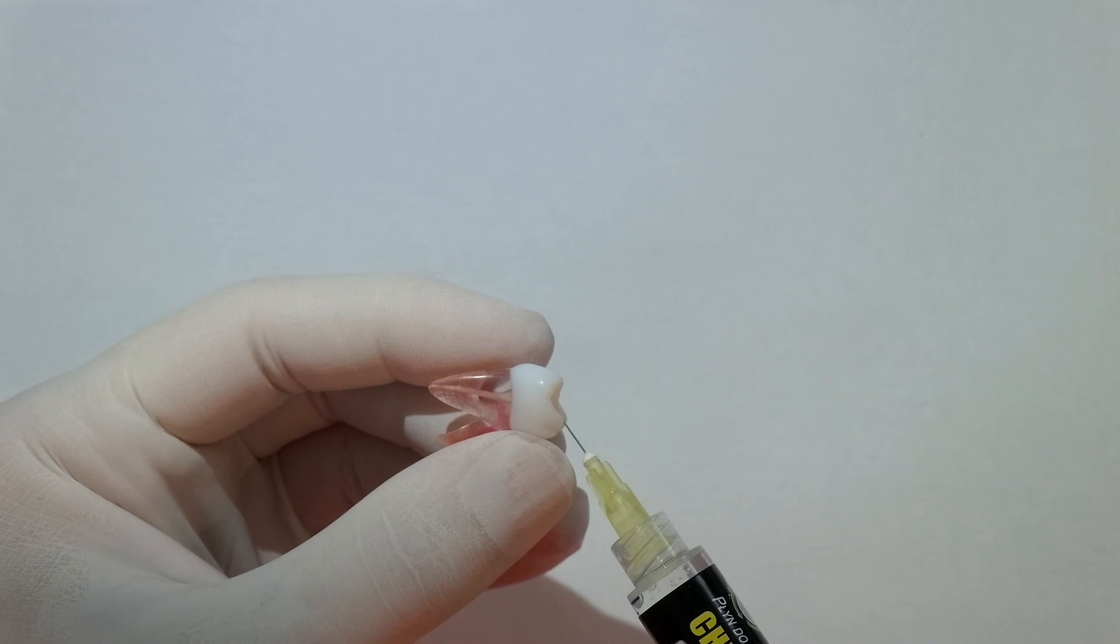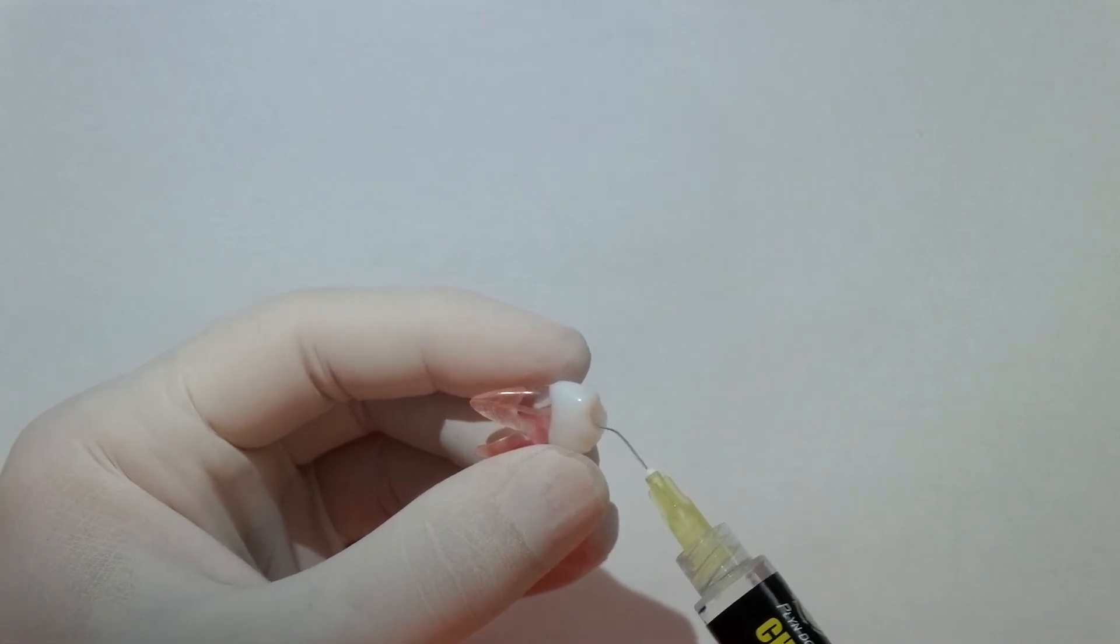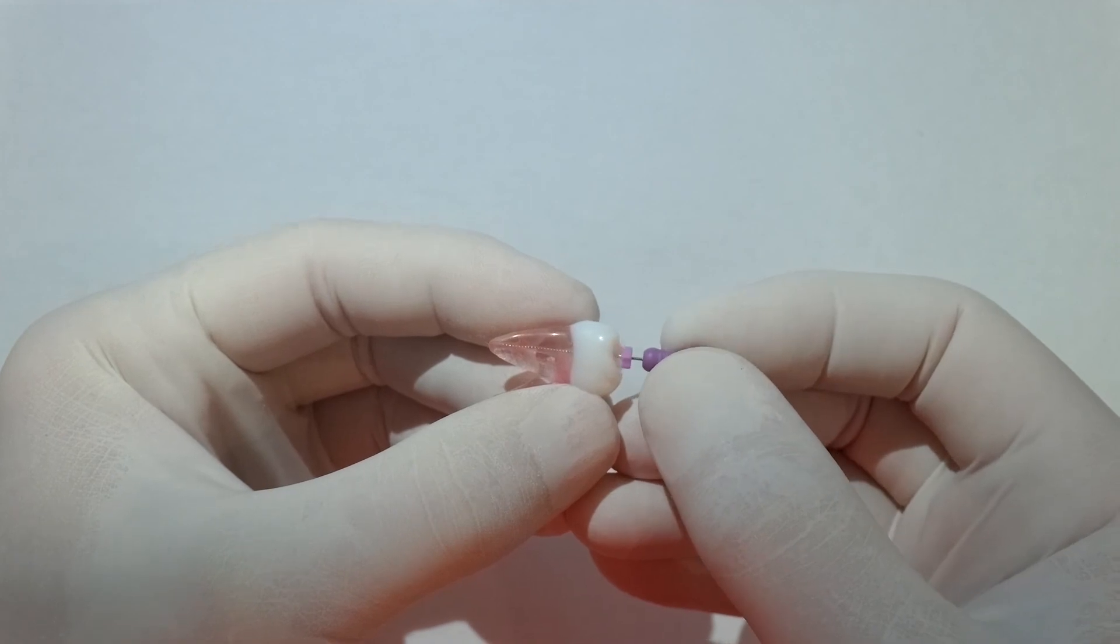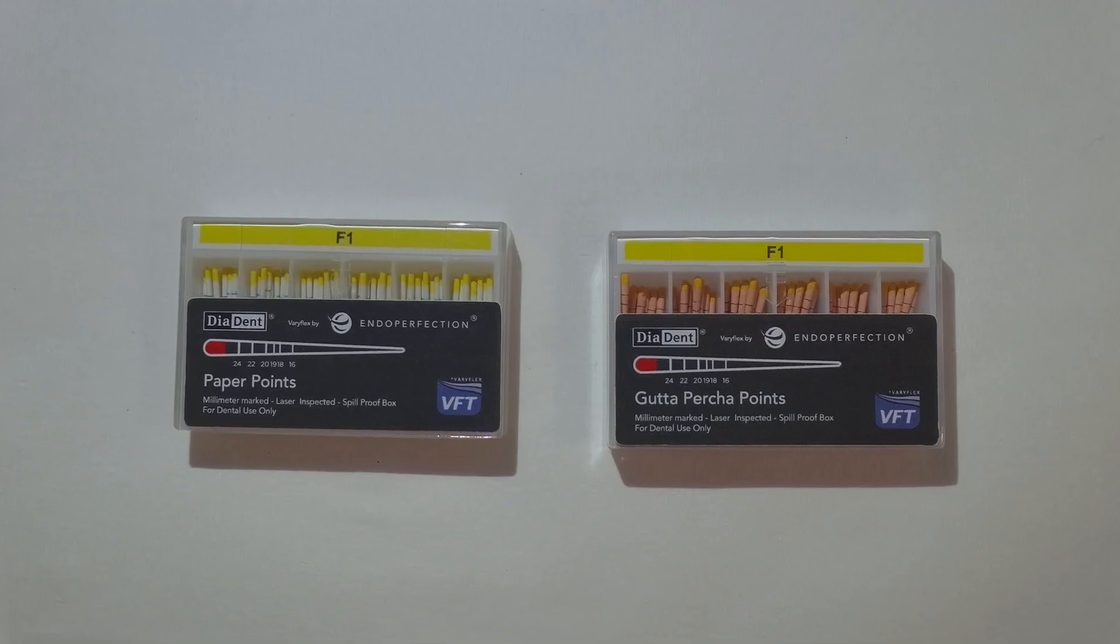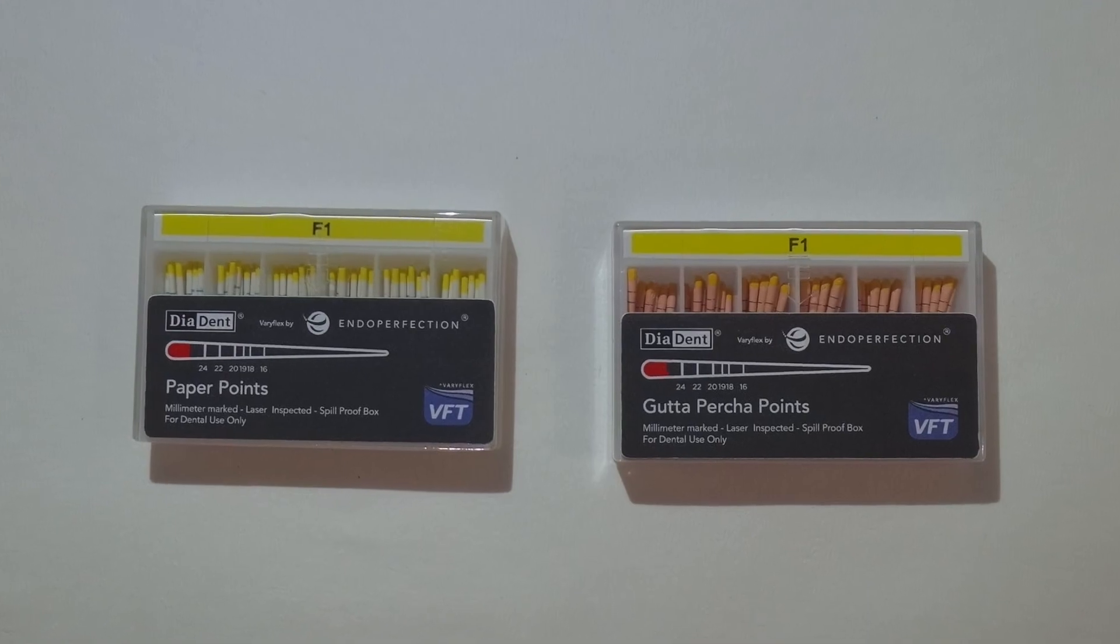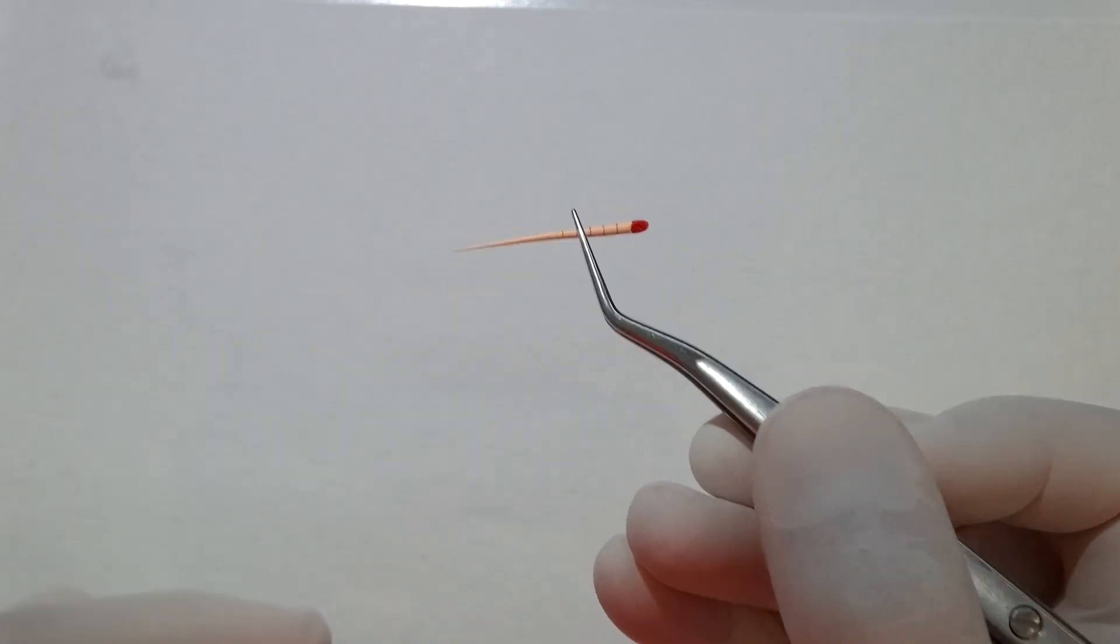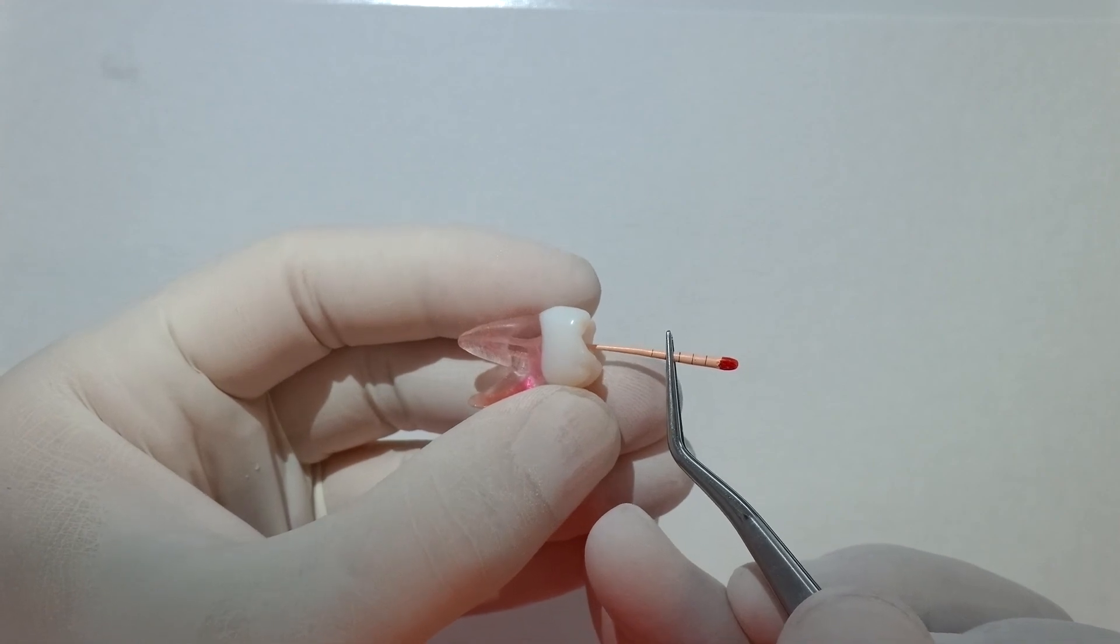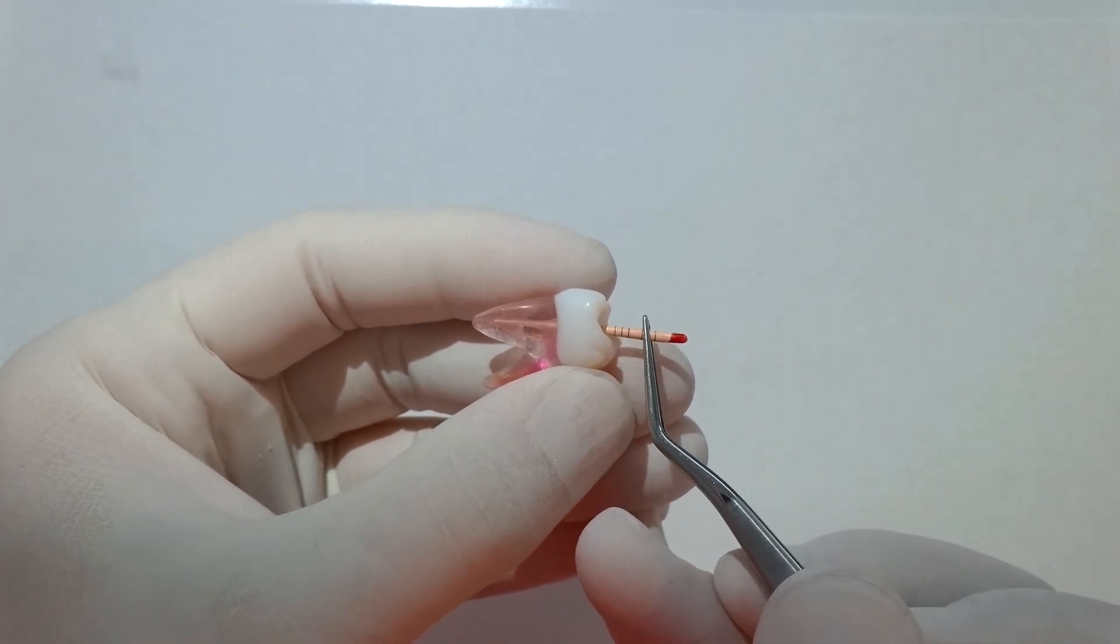Final irrigation, patency file, and then just to show you, we've got matching GP cones with all the file systems here. We've gone to the F2, so we've got our matching F2 GP cone. Once we place this in to length, you can see through the tooth that fits beautifully.